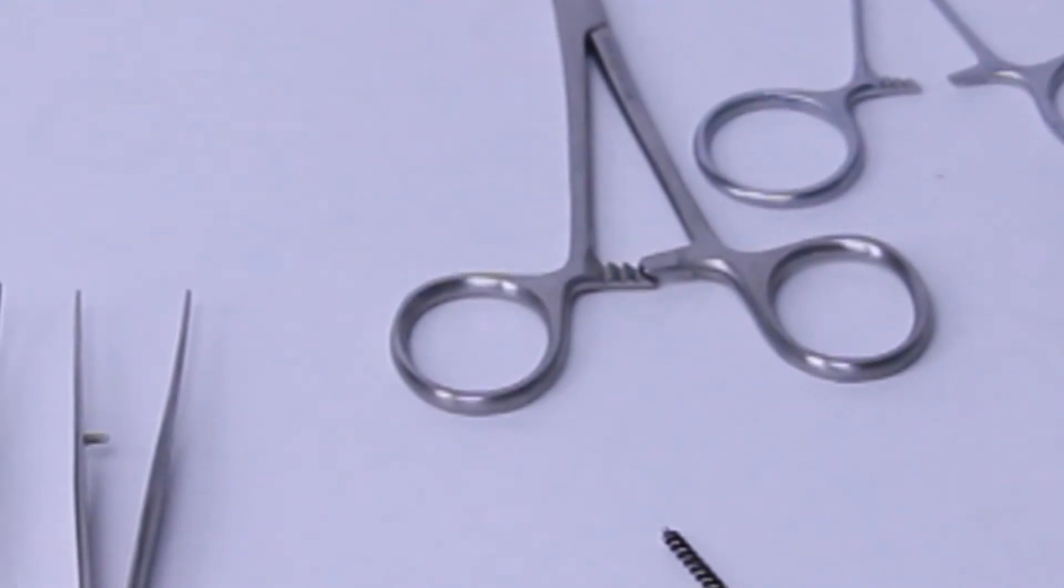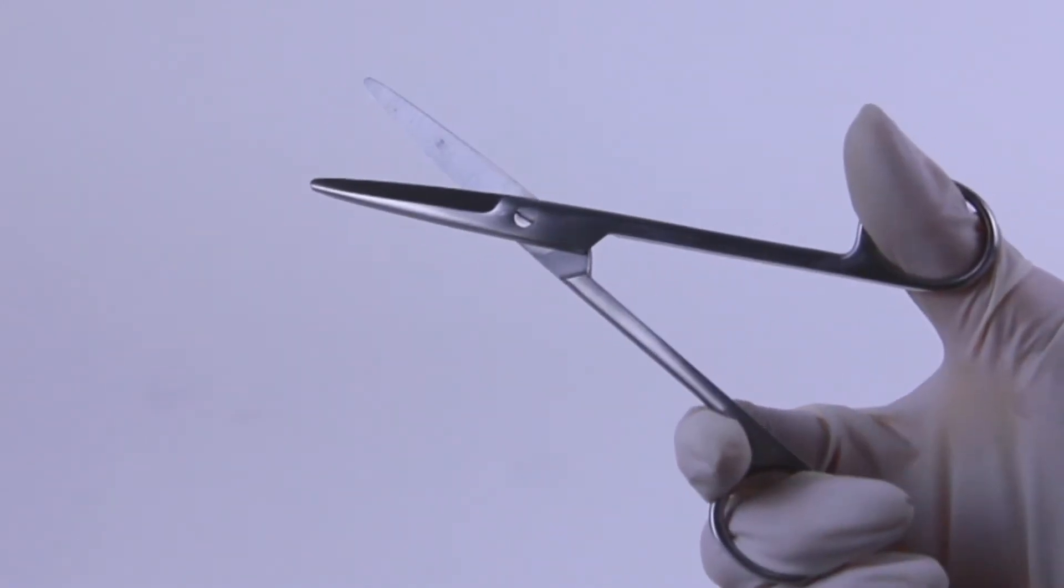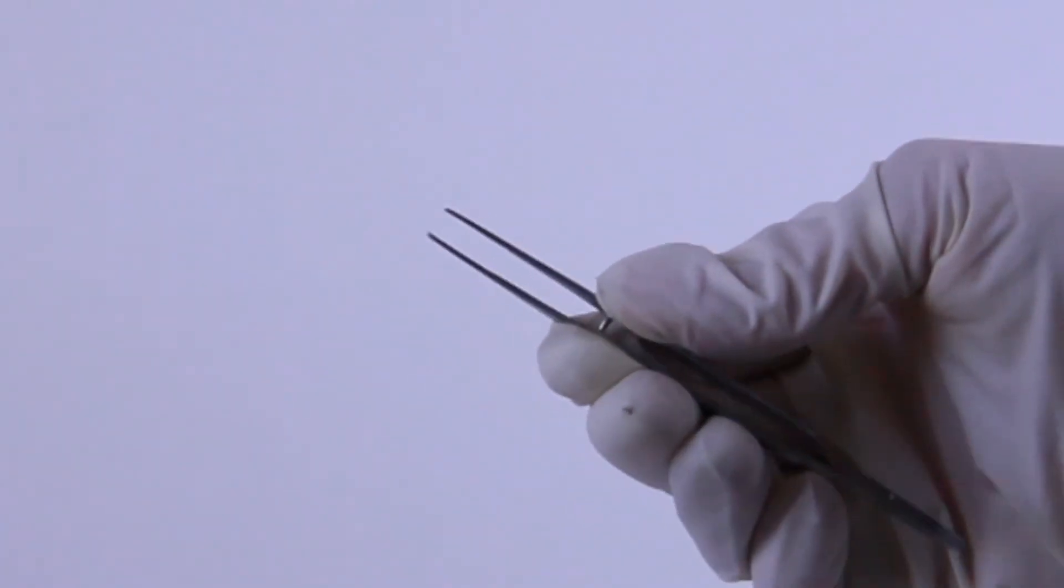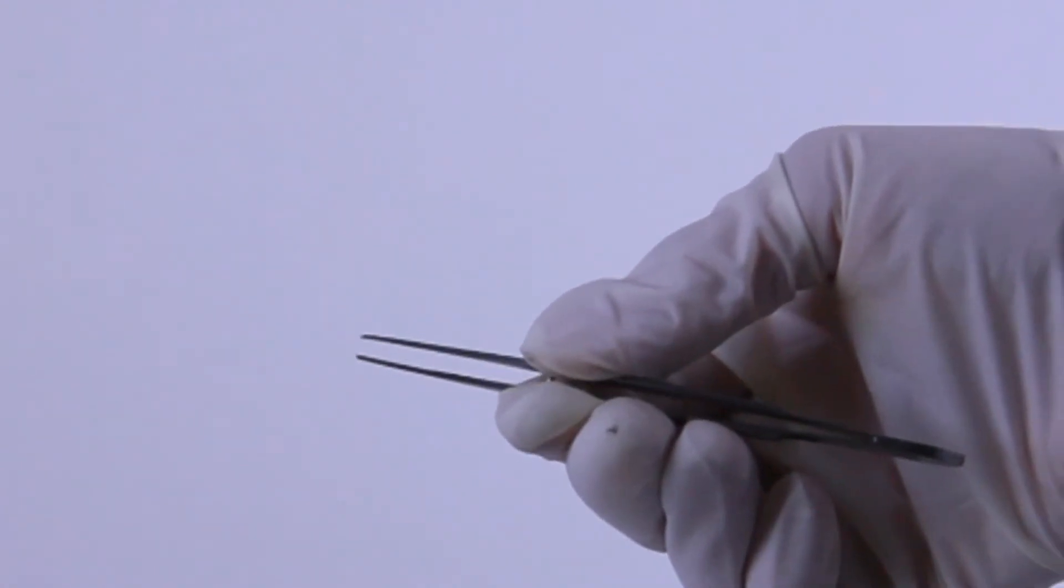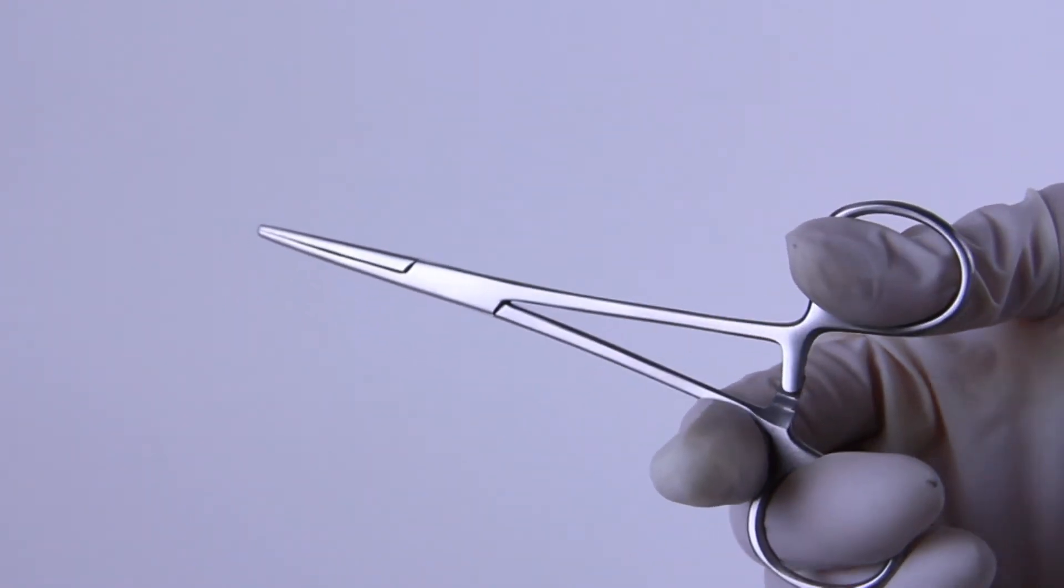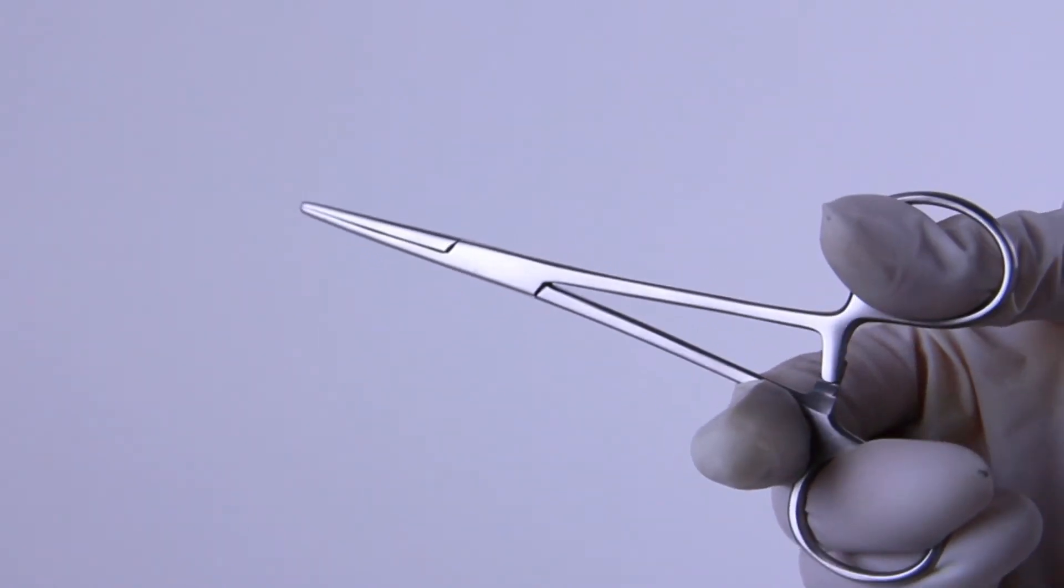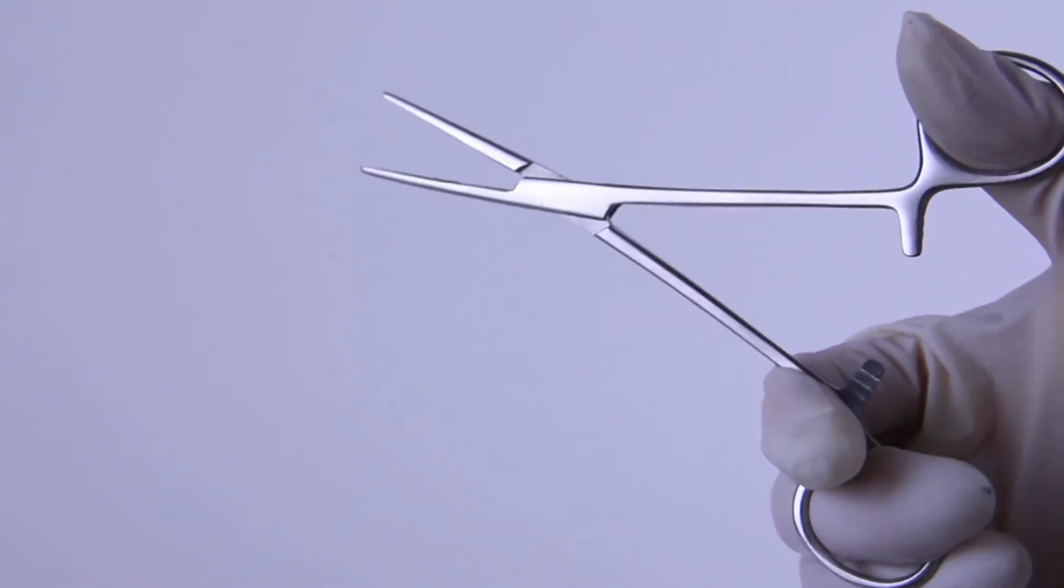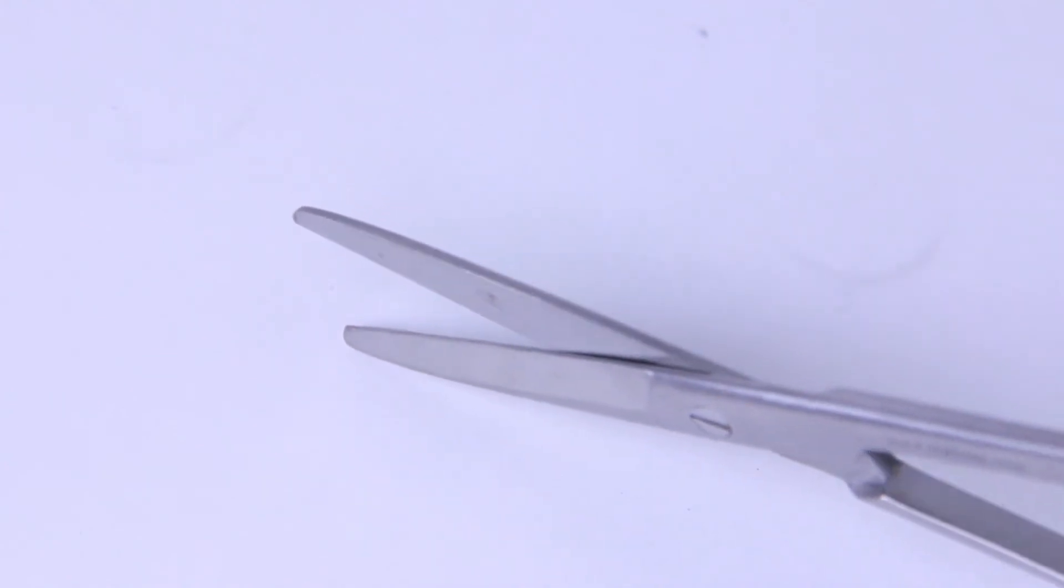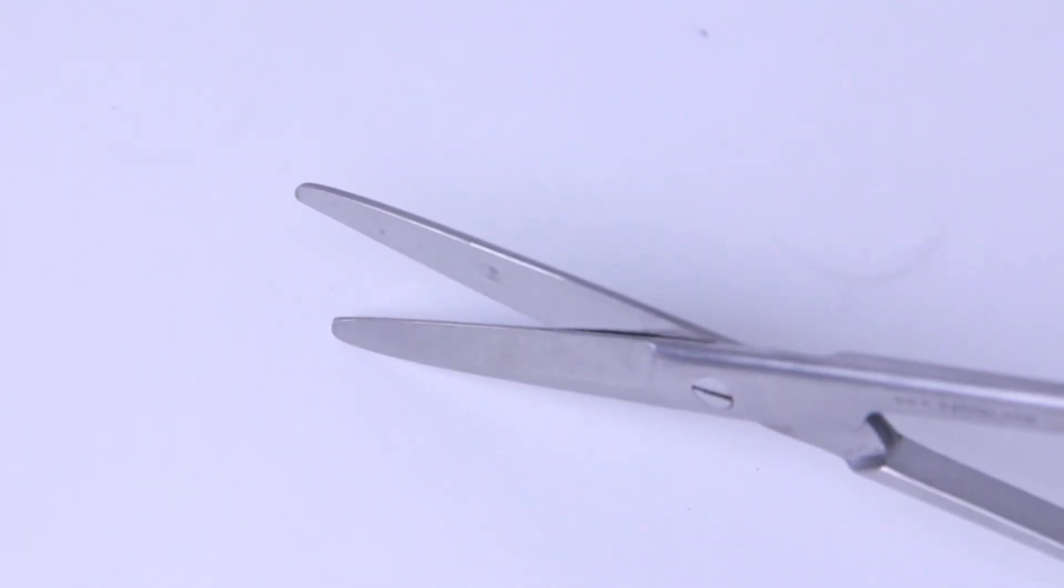Inspect each instrument for proper function and condition. Scissor blades should glide smoothly, and the blades must not be loose when in closed position. Check that forcep tips are properly aligned. Hemostats and needle holders should not show light between the jaws. They should lock and unlock easily, and the joints should not be too loose. Check needle holder jaws for wear. Examine cutting instruments and knives to be sure their blades are sharp and free of nicks and chips.